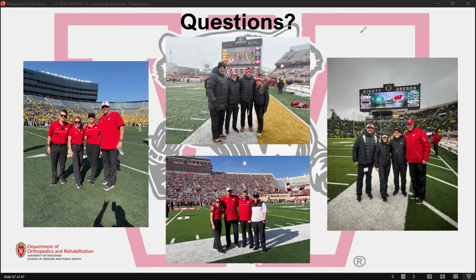And then two other things you had covered the areas, but just had mentioned as potential diagnoses that you can also see. You had mentioned with the MCL, of course, you can have sprains and tears in that area, but you can actually get bursitis or bursal distension as well, typically along that proximal aspect, and that's known as Voshell's bursitis. So something to keep in mind. And then the other, you had covered the meniscus, and we'd covered this in other AMSSM ultrasound case series presentations as well. Just knowing that you can get perimeniscal cysts in that region too that can actually become very large.